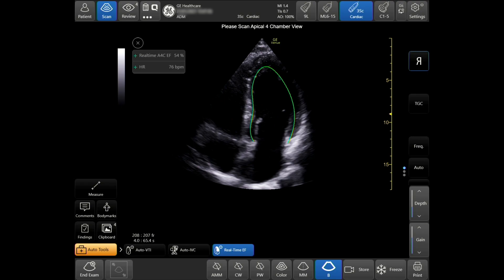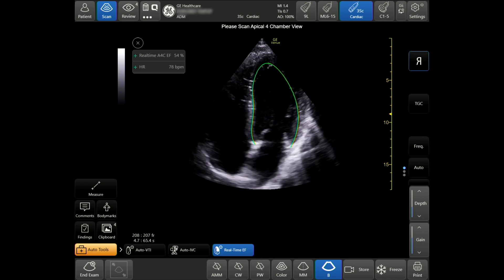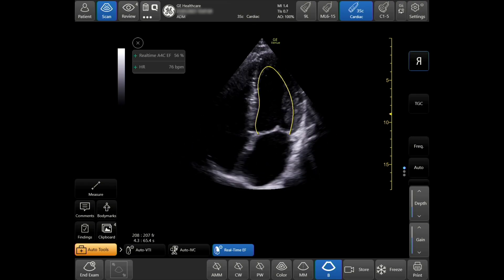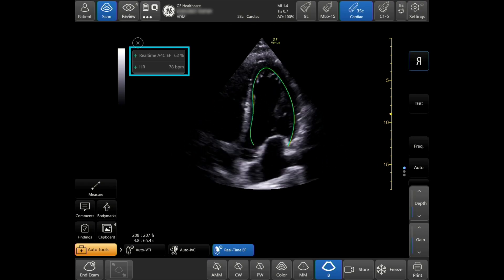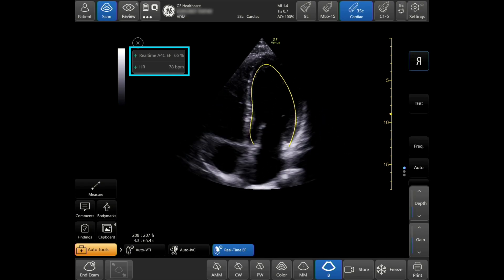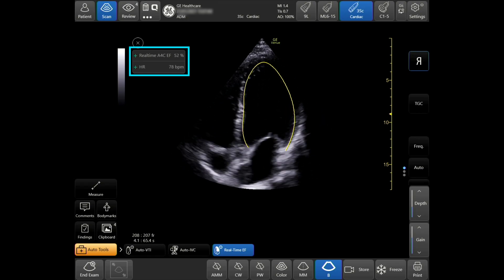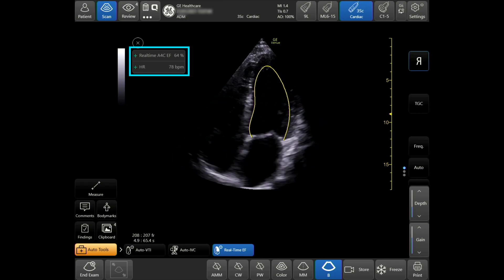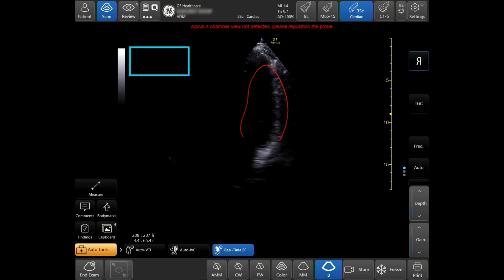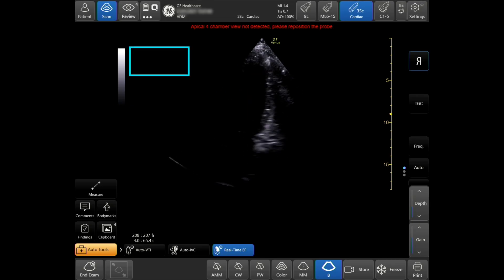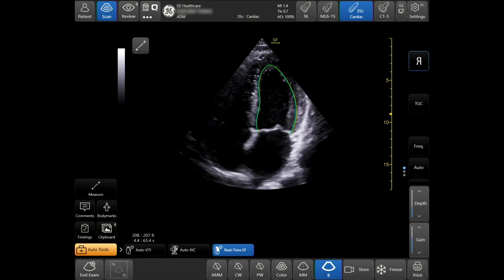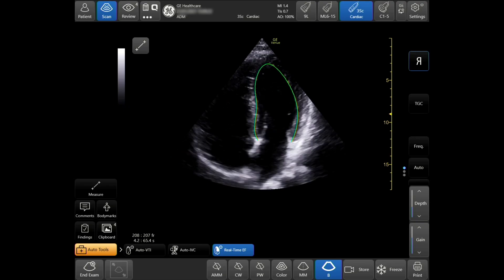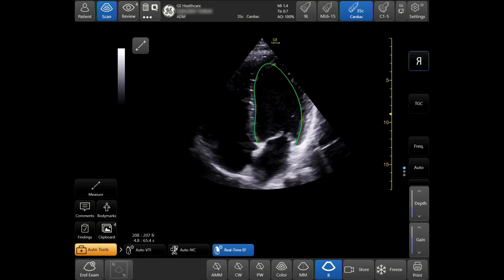Your quality indicator will now be displayed. When green, the results are highly likely to match calculations created by an expert. When yellow, the results should be taken with caution. When red, no results are shown on the system. Ejection fraction and heart rate calculations will automatically be displayed in the measurement window.